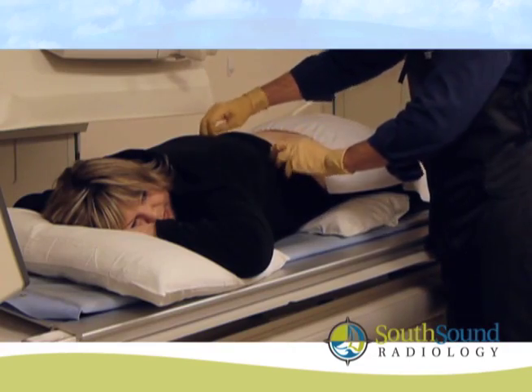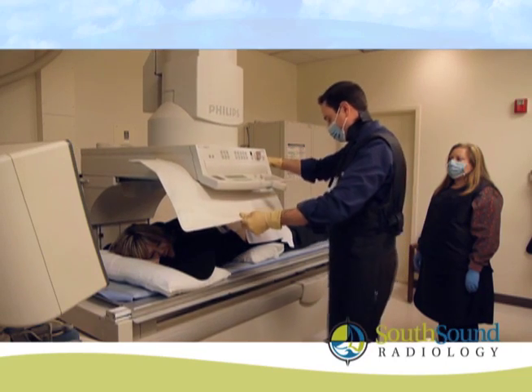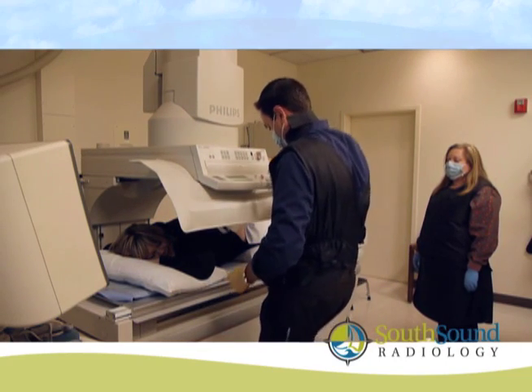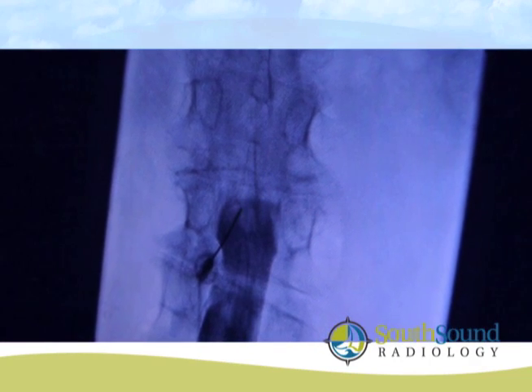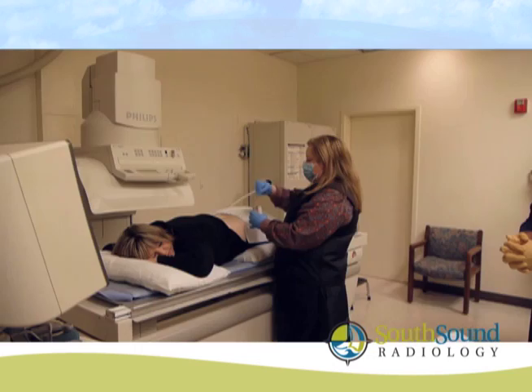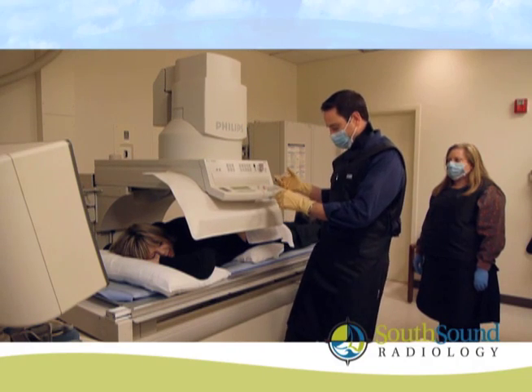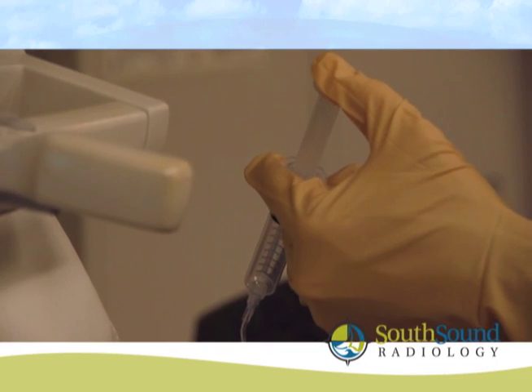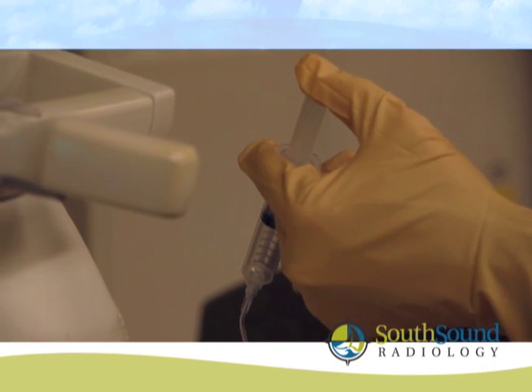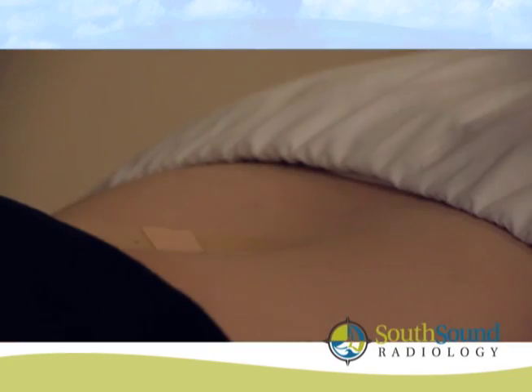You will be positioned face down on the examination table. The radiologist will use the fluoroscope, which projects radiographic images in a movie-like sequence onto the monitor to visualize the spine and determine the best place to inject the contrast material. The skin will be marked, cleansed, and then numbed with a local anesthetic. A needle is advanced, under fluoroscopic guidance, until the tip is positioned where spinal fluid is located. The contrast material is then injected, the needle is removed, and the skin at the puncture site is again cleaned and a bandage applied.